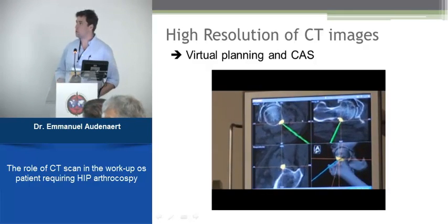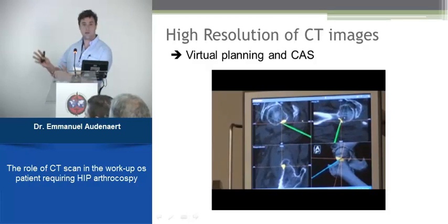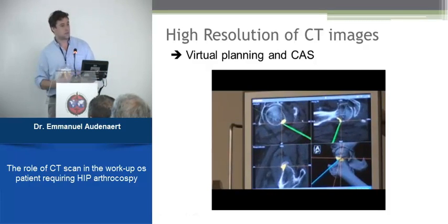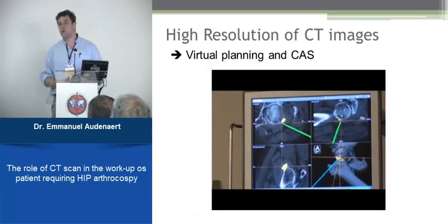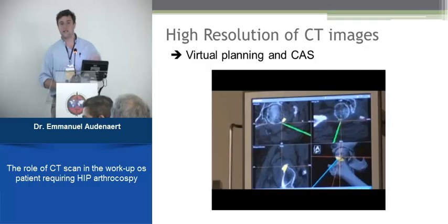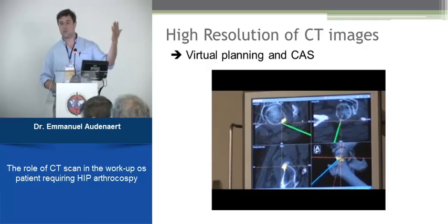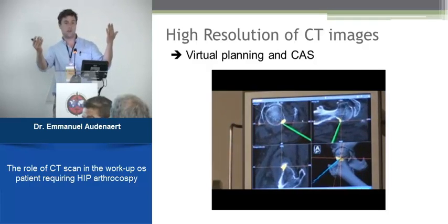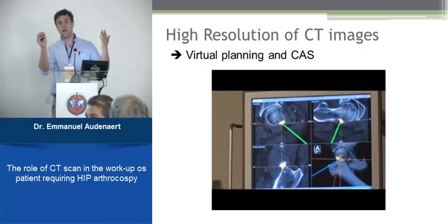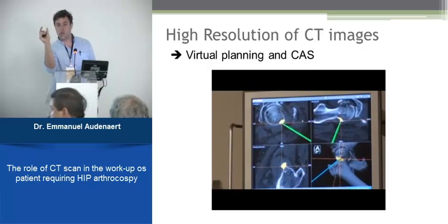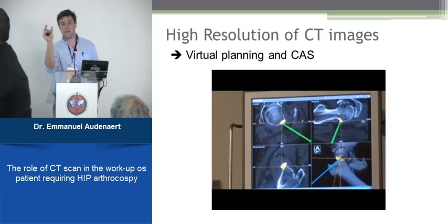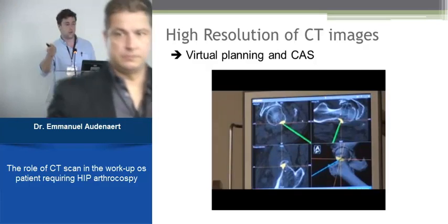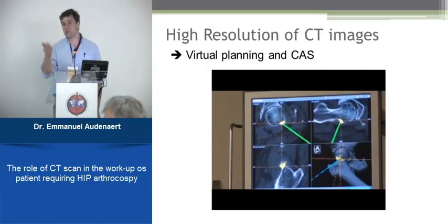This is a very nice video of a navigated hip arthroscopy. The beauty of it is that next to your screen — on what you see with your hip scope — you get a full 3D view of the hip, and you see the lesion that you planned, you see where you are with your tools, how much bone you take away. It's a treasure.